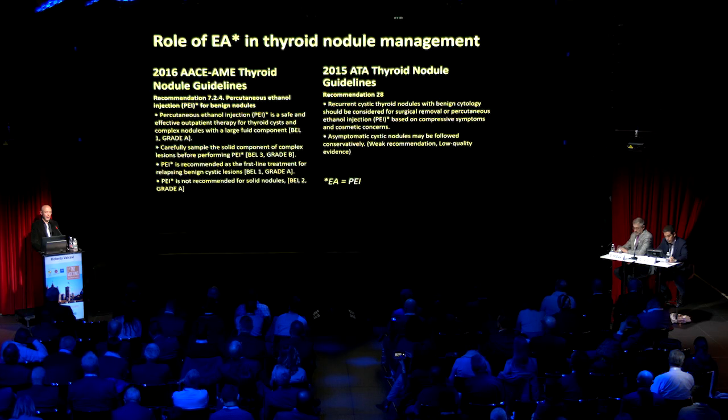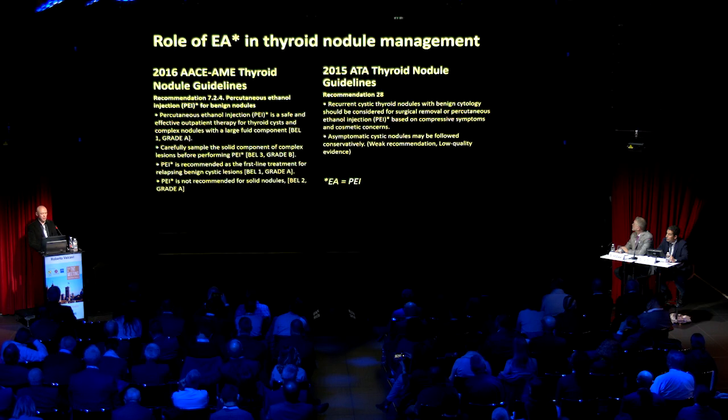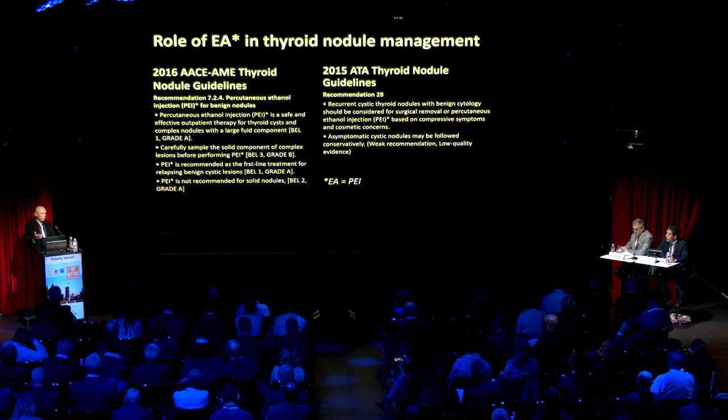And of course, as said before, you should carefully sample the solid component of the lesions before performing PEI. And in this guideline, PEI is recommended as the first line treatment for relapsing benign thyroid cystic lesions, that we saw are the vast majority of lesions. Most of them, if you drain only, will relapse.